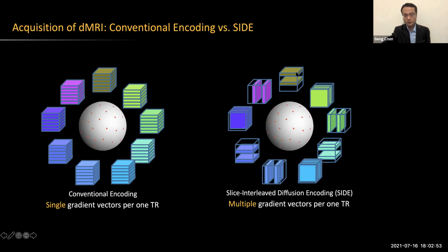And we can also say that for this one and this one, the slice selection directions are the same, but the final selected slices are different, right? Because another parameter is an interval, where you would like to start to select the slices. We use these two parameters to control the slice selection in different diffusion weighted volumes, so that the complementary information can be maximum among the diffusion weighted volumes.